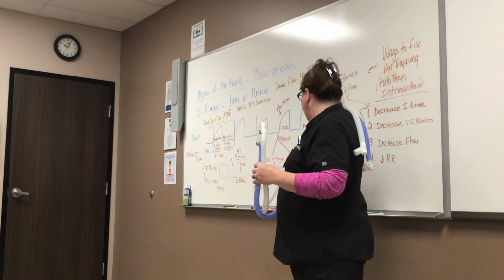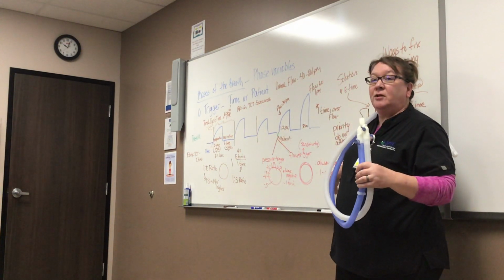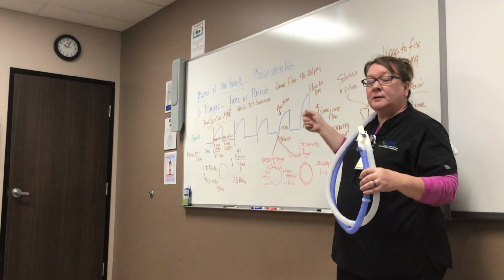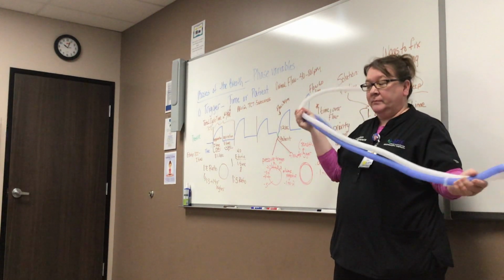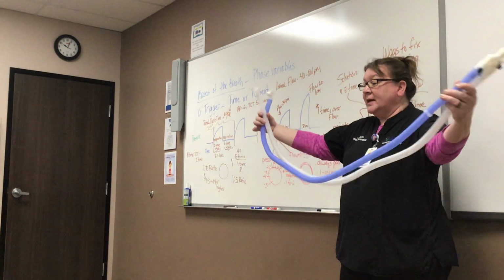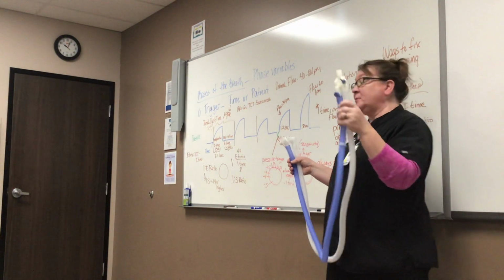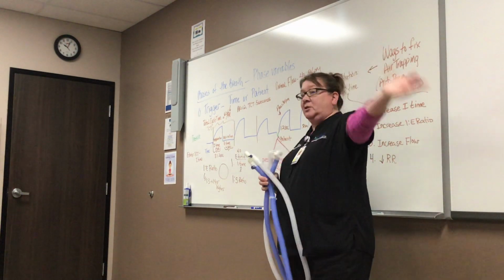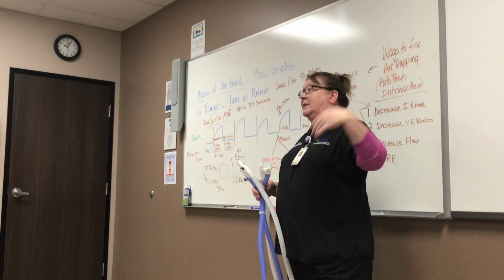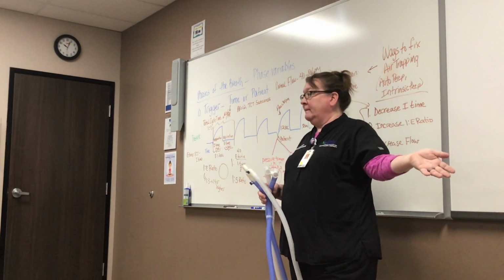And this is set differently on the ventilators. So typically flow trigger, we leave it at default. Like the Servo, it says as long as it's in the green. But between 1 and 10 is normal for flow trigger. So say you set it at 2, you just told the vent when the flow drops by 2 liters per minute, give the patient a breath, because that means the patient took some of it. As opposed to saying -2, which senses a drop in pressure of -2.